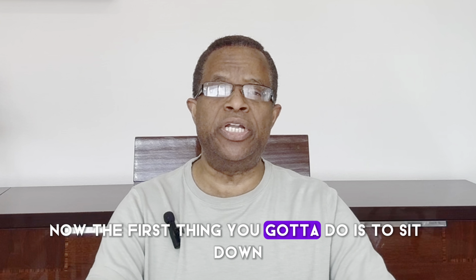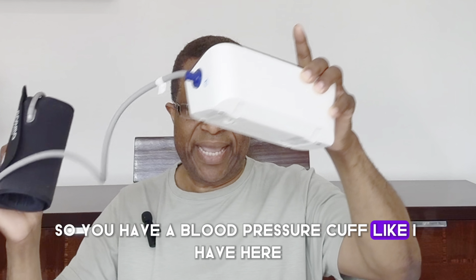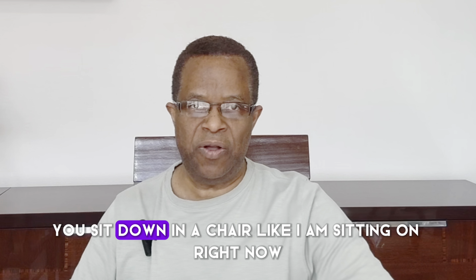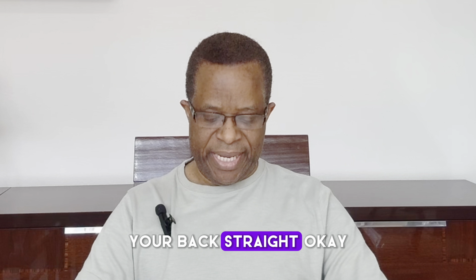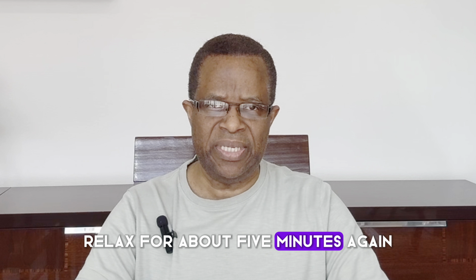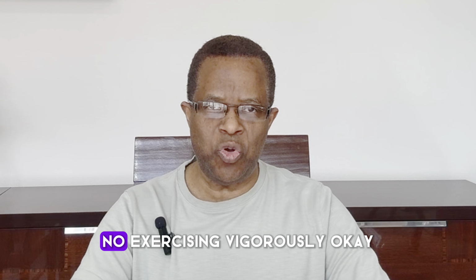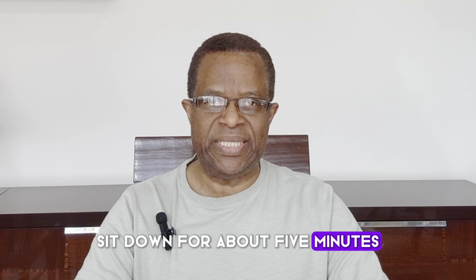Now, the first thing you're going to do is to sit down. You have a blood pressure cuff like I have here, this machine. You sit down in a chair like I am sitting on right now, your back straight, okay? You're going to relax for about 5 minutes. Again, you have not drank coffee. You are not working yourself out, no exercising vigorously, okay? Sit down for about 5 minutes.